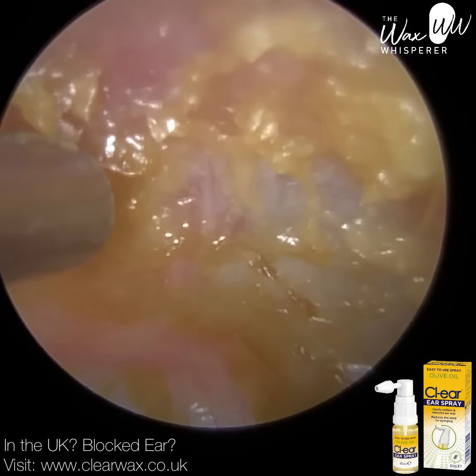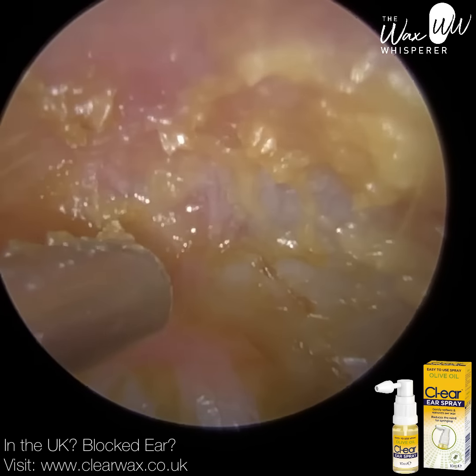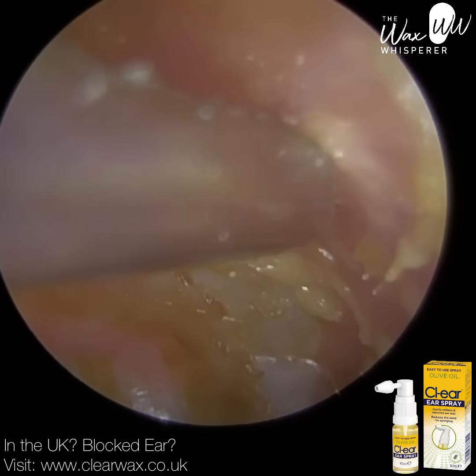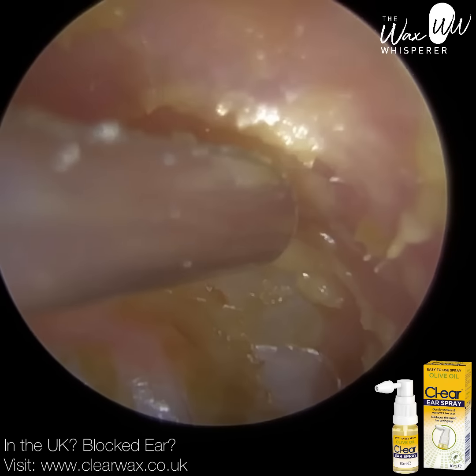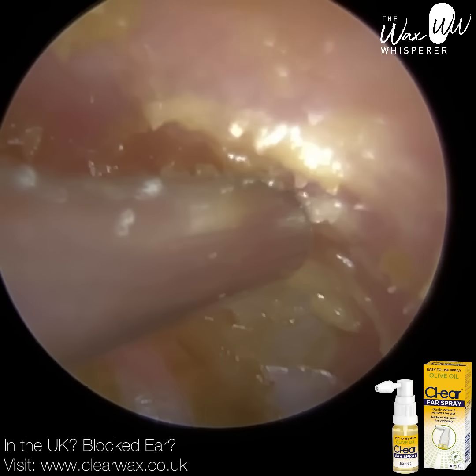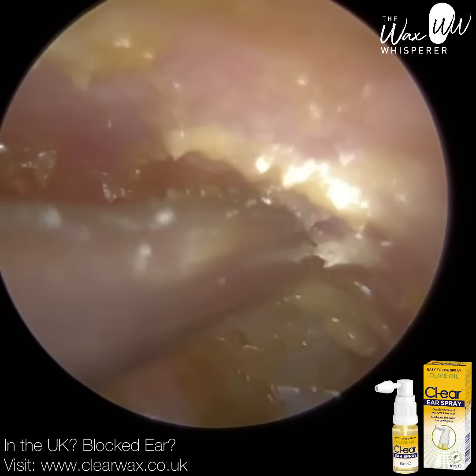And as I said, using the fine end, just slowly but surely, I'm trying to be as gentle as I can and remove as much as possible. We're not going to get every little speck of debris out. It's just not possible to do that, but I'm going to try my best to get the most out as safely and efficiently as possible.